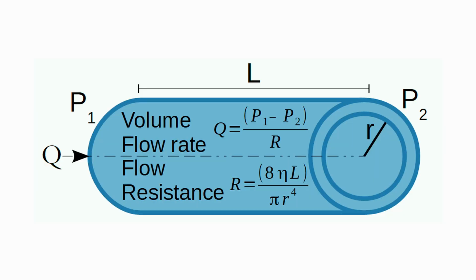And the reason for this is because a bend or a kink in the needle is an incredibly short distance overall. And one of the factors that affects extrusion force, if you review Poiseuille's law, is the distance of the narrowness. So although there is now a smaller space for the filler to flow through, that smaller space is also incredibly small. So if you think about sections of a tube, we have only a quarter of a millimeter or so where it's narrower, and the rest of it is the same.